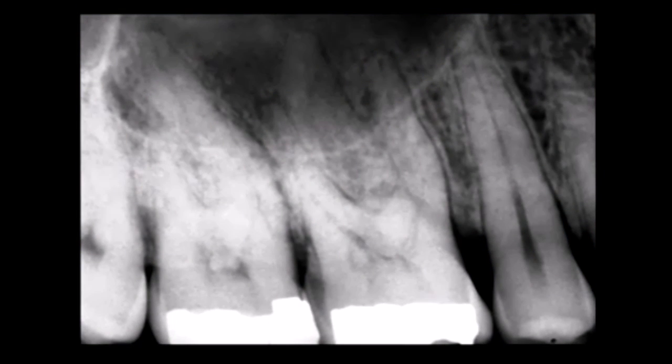This is a maxillary first molar. Notice the calcification in the pulp chamber, and be aware of the stones that appear to be projecting into the root canal system. Specifically, if we look at the MB root, we can see it's multiplanar. There's a curvature in the coronal 1/3, a distinctly different curvature in the middle 1/3, and there appears to be recurvature in the apical 1/3.